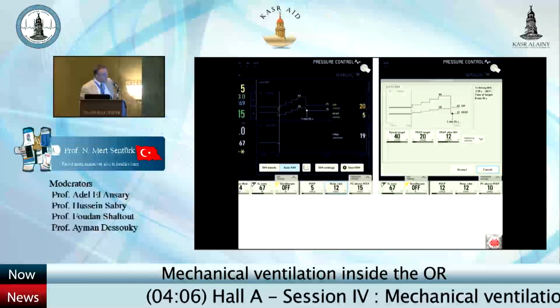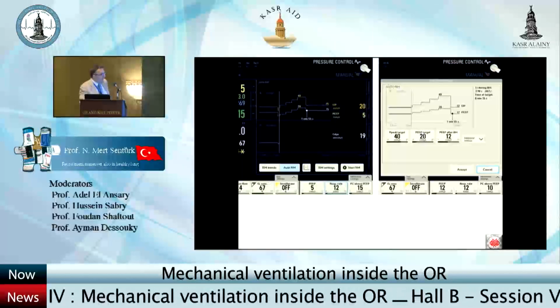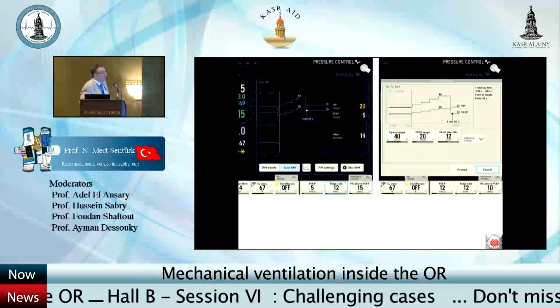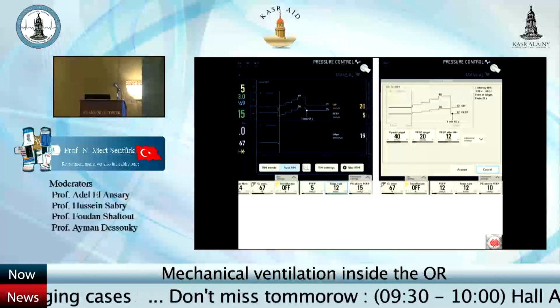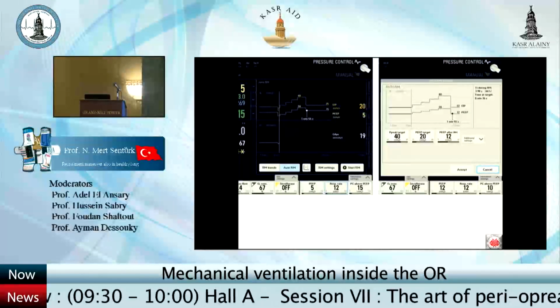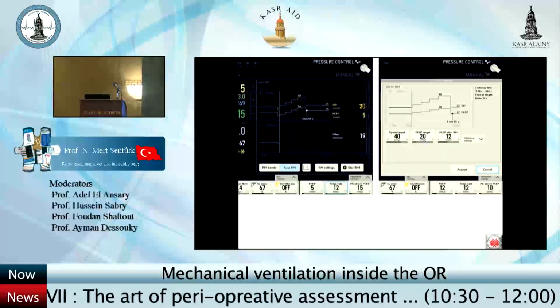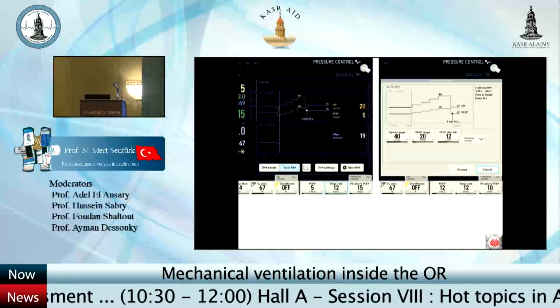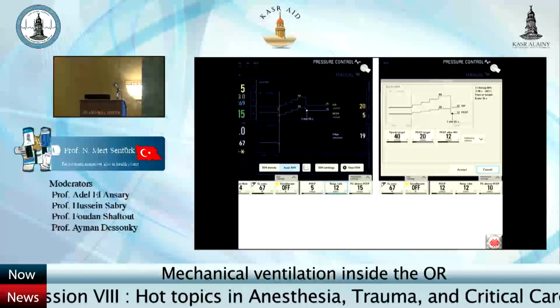Newer anesthesia machines are, thank God, capable enough to apply the recruitment maneuver in physiological ways too. You only have to give your steps of the peak inspiratory pressure and the timing of these steps of the staircase. Afterwards, you just have to push the start button, and you also have to set the peak pressure.